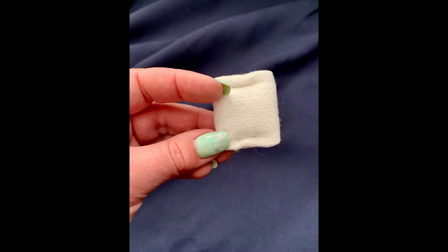12 French. When placing the product, you will notice two stitch sites on the pad. One stitch should sit just about a quarter of an inch past the skin puncture site. This will allow for the second stitch to approximately be over the arteriotomy site, allowing for appropriate placement of pressure when we're doing a sheath pull.